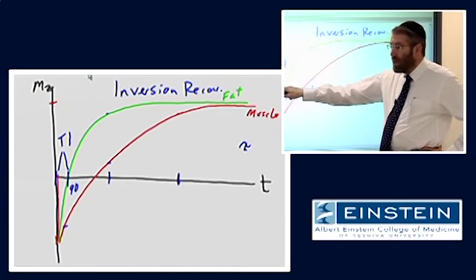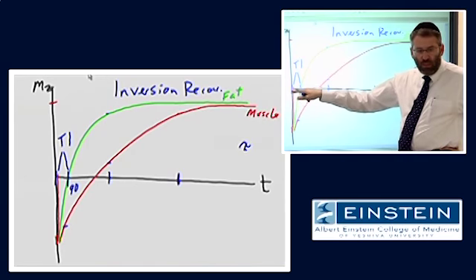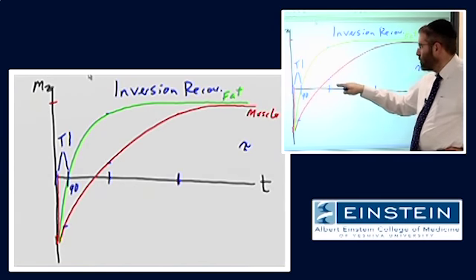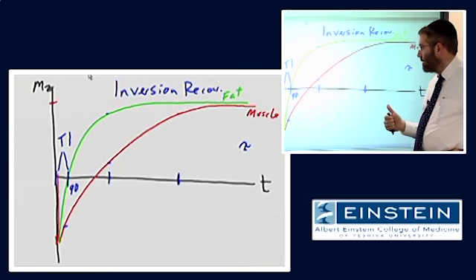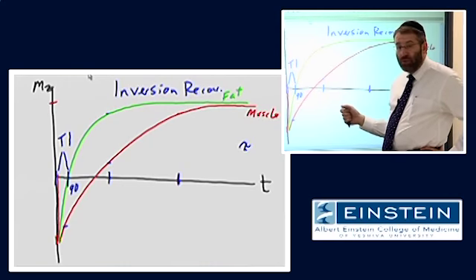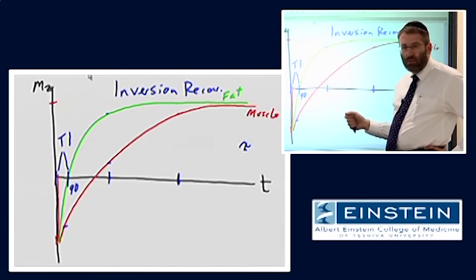And that parameter, which is a new parameter we haven't dealt with yet, is going to alter the T1 contrast in our image, first of all. Second of all, it will affect signal to noise.